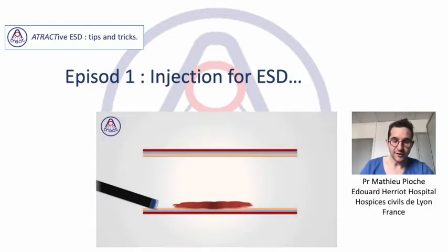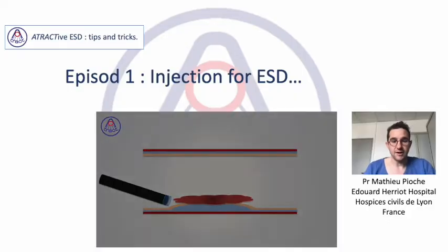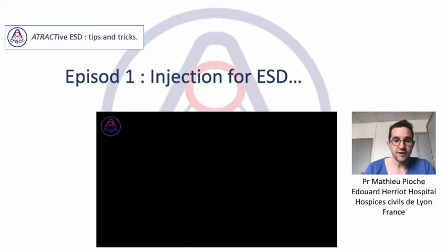So, dear all, we are pleased to present you the first episode of our podcast about ESD, trying to share all our tips and tricks. And today, the main topic will be injection for ESD. We will see that many tricks exist for injecting.